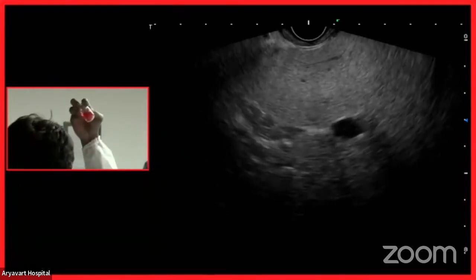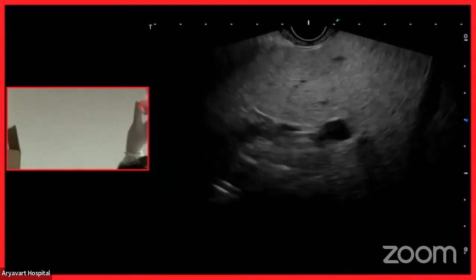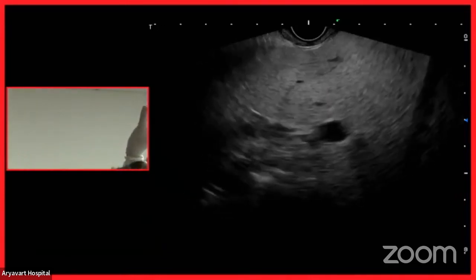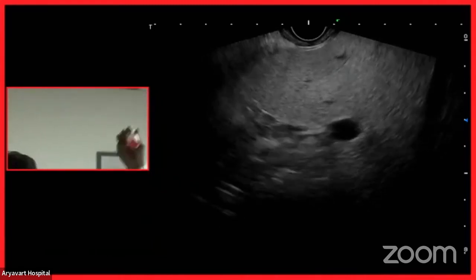Can we take the 19? Okay, I think it is fragmented, but we can see it between. The long segments are also there. So I think it's okay.